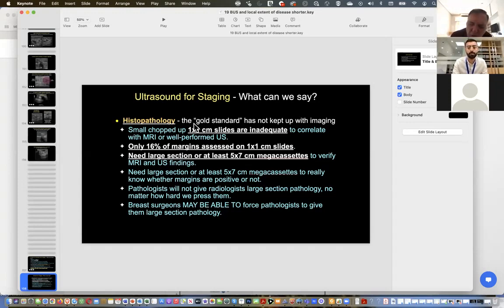Is the seroma in the axilla or is the seroma in the breast? Yeah, you have seroma at the site of the surgery, but she has an axillary lymph node with some suspicious findings of eccentric cortical thickening. Is there any evidence that there's infection in the seroma? No, just only slight skin discoloration, red discoloration of congestion. Right.